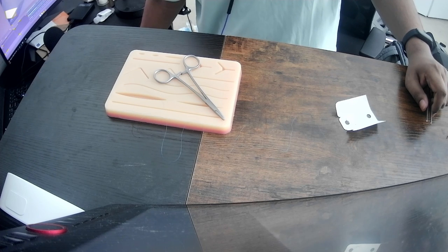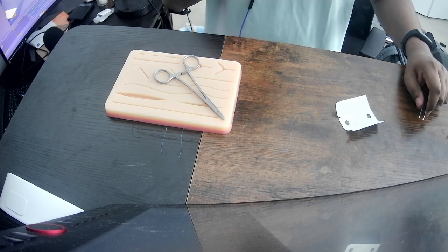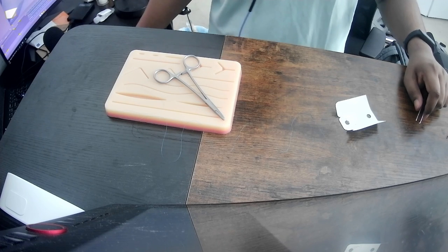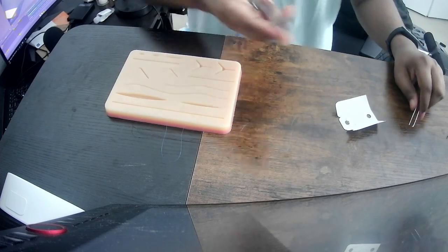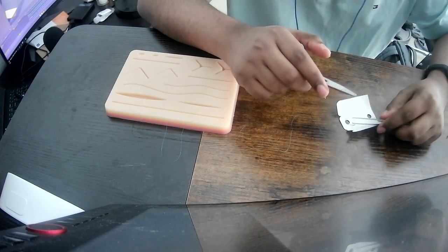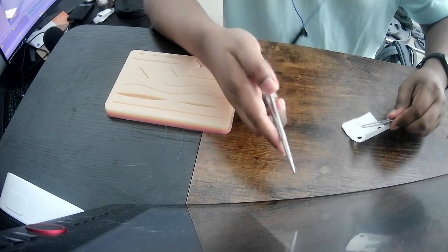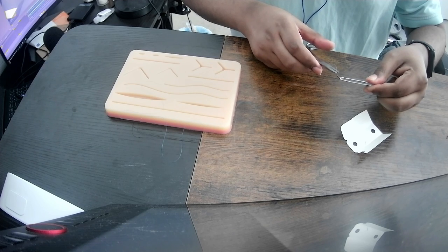Let's see. Put it on the tip of the needle to any tissues or structures. You want the needle to be on the end, just so it's as easy to use as possible. Oh yeah, that's a good point. The video I'm watching just mentioned that where you load on the needle driver actually matters. The further up, that's less. I guess let me show you. Okay, let's load it. Oh, that was so much easier this time. So if I bite it at the tip.